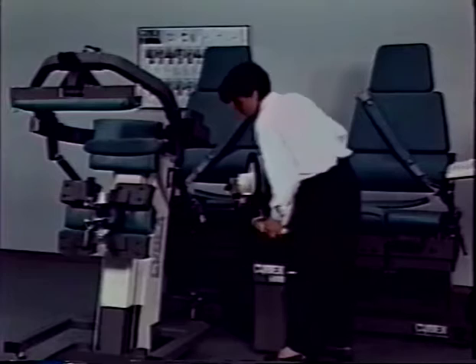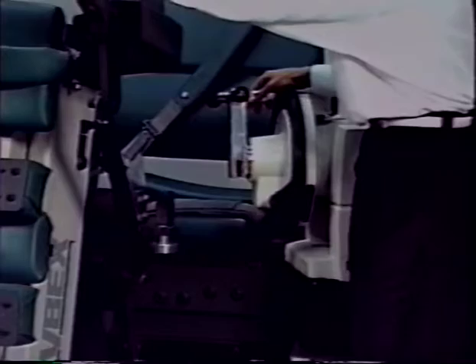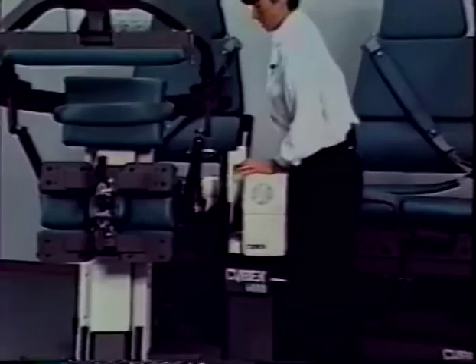Adjust the dynamometer input tube to a vertical position — the tube should be facing up. Pull the TEF modular component towards the Cybex 6000 dynamometer. Line the input tube with the dyno docking adapter and then push the dynamometer down so that the dyno docking adapter fits into the input tube. Now secure the dynamometer.